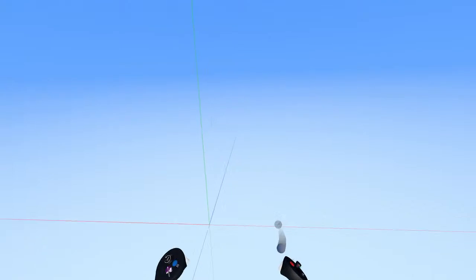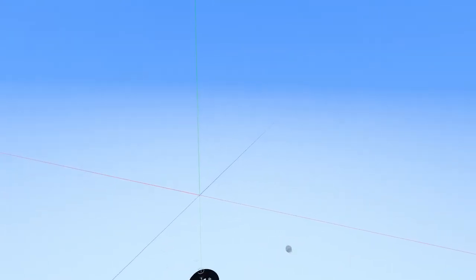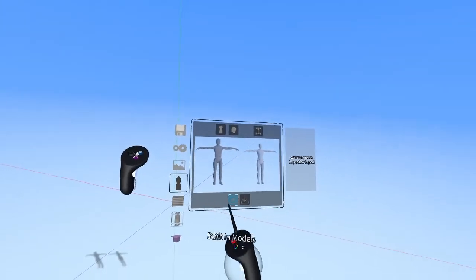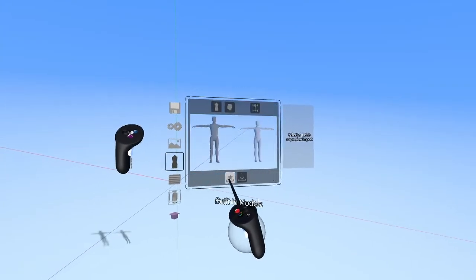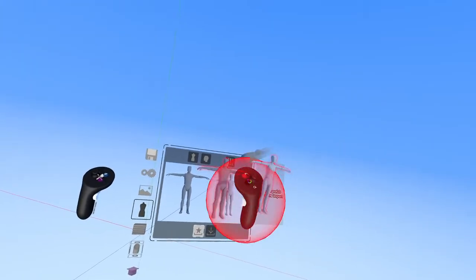All right, cool. So considering the fact that we're making a piece of surgical equipment, a system performing operations on the human body, we're going to want to design this so that it's at human scale. So to do that, let's press the blue menu button here, go to Prefabs, and we have these built-in models, and that's of course under the built-in model tab. You can also bring in your own models here, and we might do that later, but for right now we're just going to leave it on built-in models and focus on grabbing one of these mannequins out and using them.